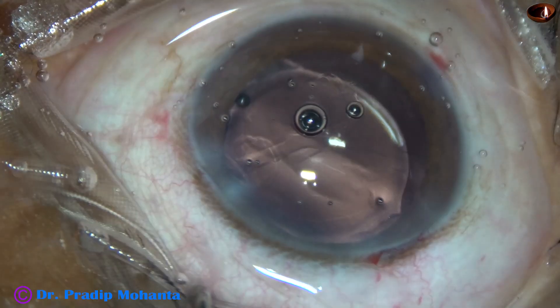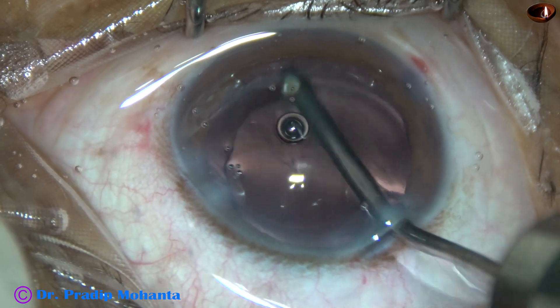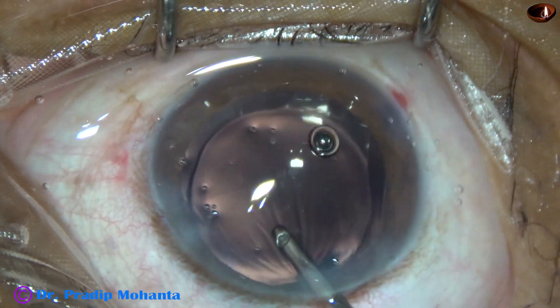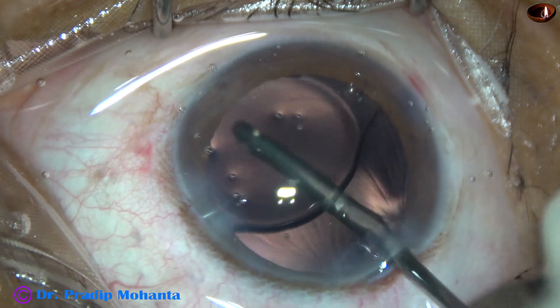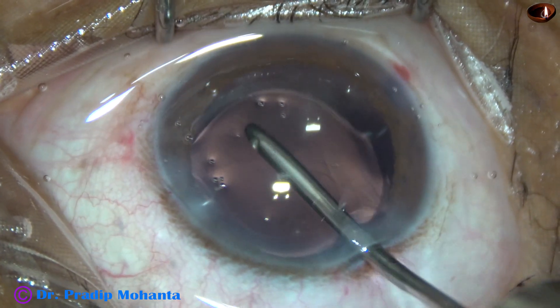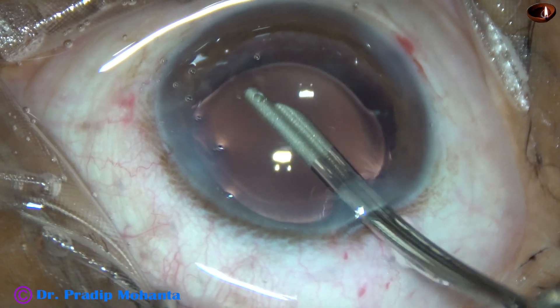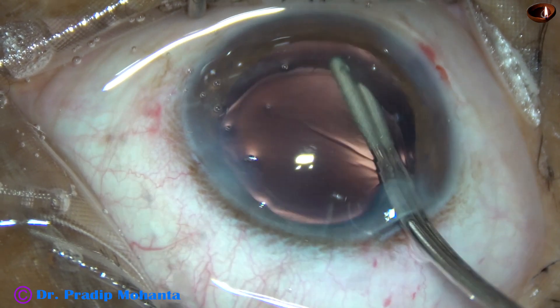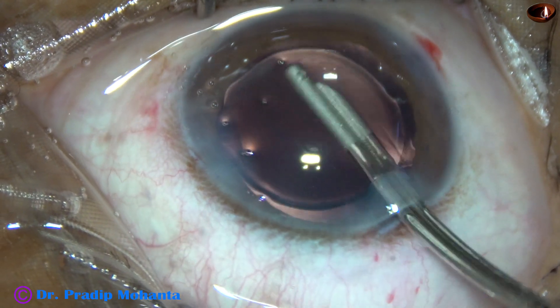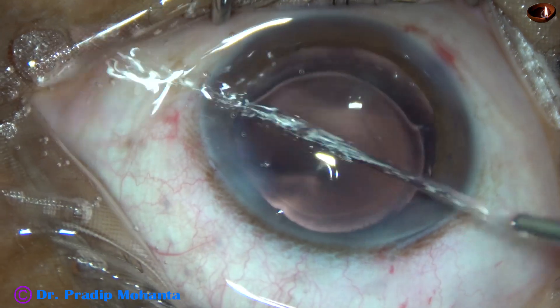The lens has gone into the capsular bag. Whatever visco was there in the lumen of the cartridge is getting removed. Here I am polishing the undersurface of the anterior capsular rim, and now I polish the posterior capsule at 6 o'clock. After implanting the intraocular lens, we can polish the posterior capsule and the undersurface of the anterior capsular rim. After this, we just close the side ports to finalize the anterior chamber and conclude the case. Let us see another case.